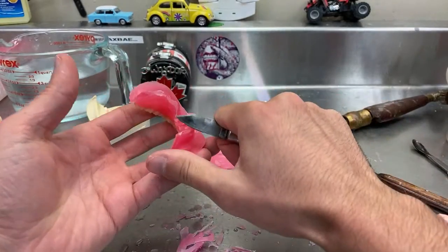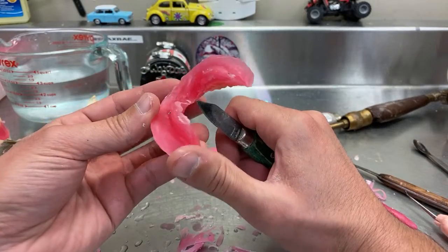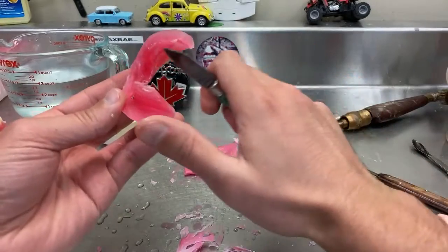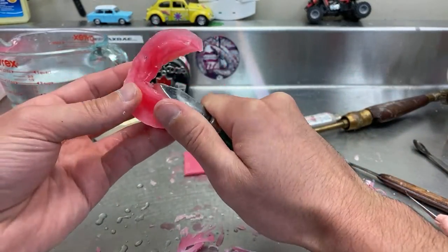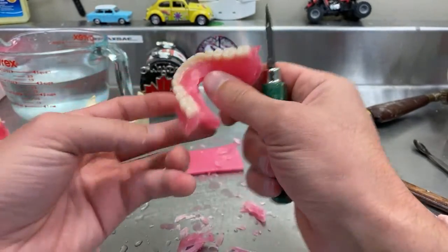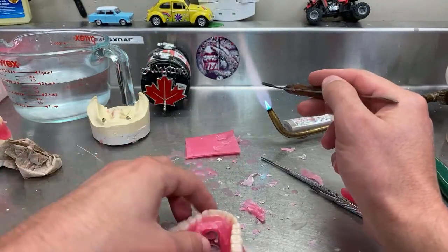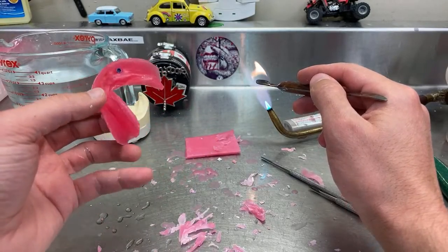Just be careful where your thumb is so you don't create any pressure. That's the reason I'm doing it that way. Putting my finger here, my thumb, and the hot knife as well, so you don't distort it. And then we go to our favorite way, the sizzling.